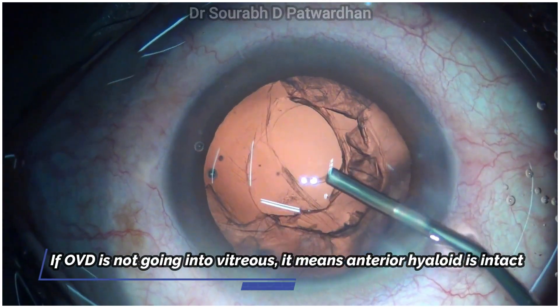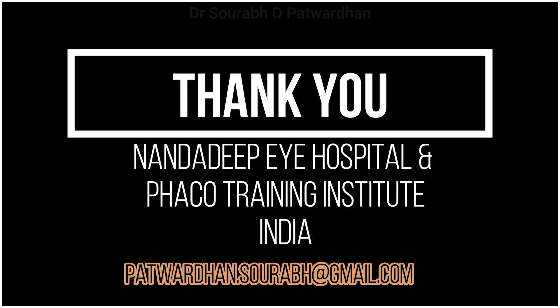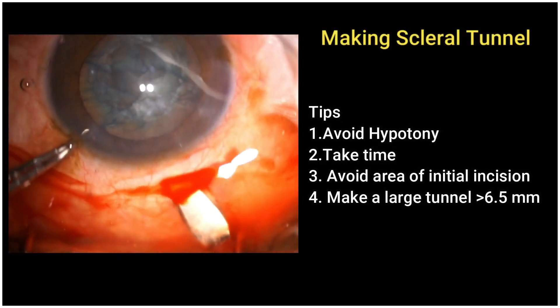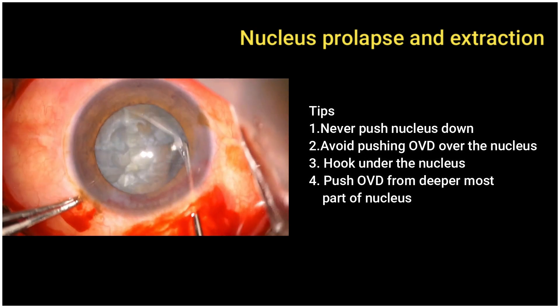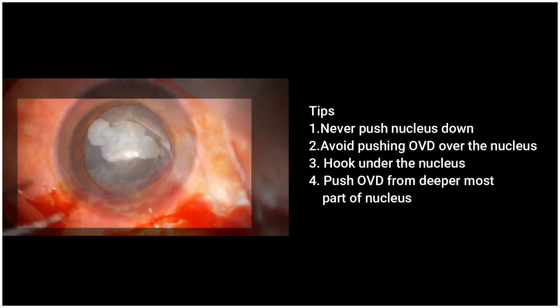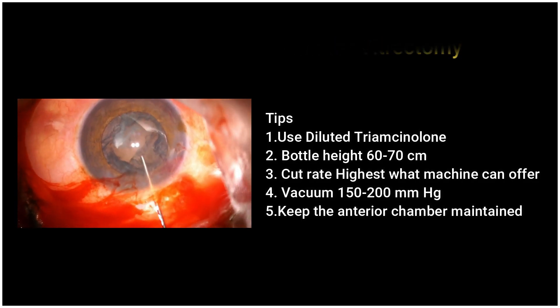Once you know how to deal with PCR, surgery results are much better and you don't have to worry. These are a few important tips about how to make a scleral tunnel, how to remove the nucleus from the bag using a ball-tip chopper or the 2-Sinskey method, and how to do a good anterior vitrectomy with the correct settings. You will have a good outcome even after posterior capsule rupture.